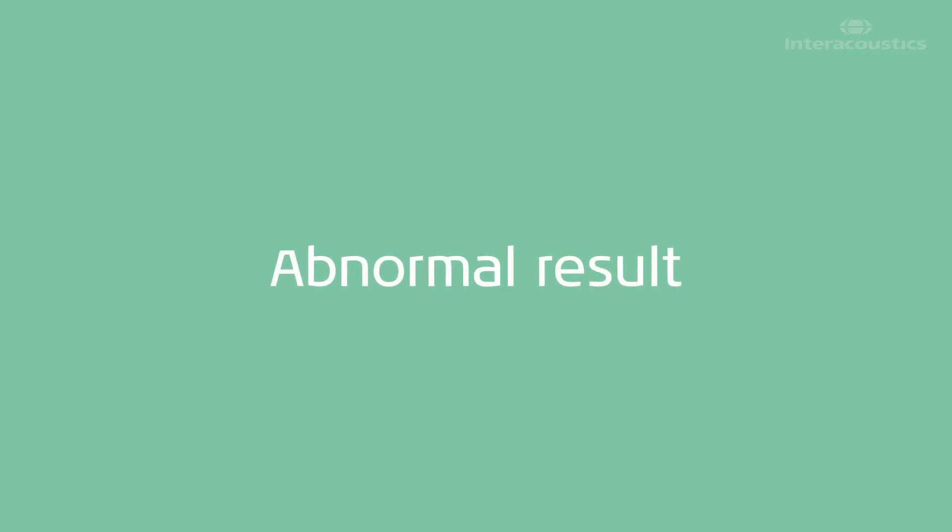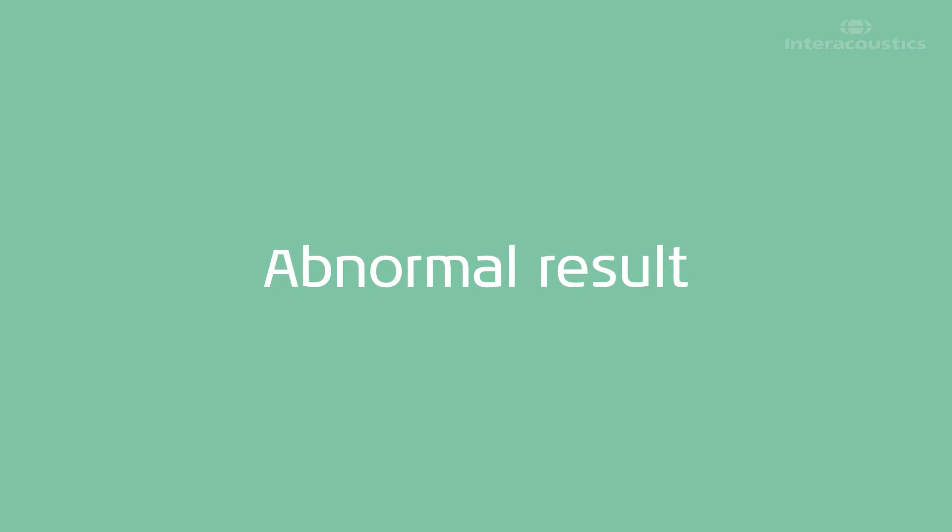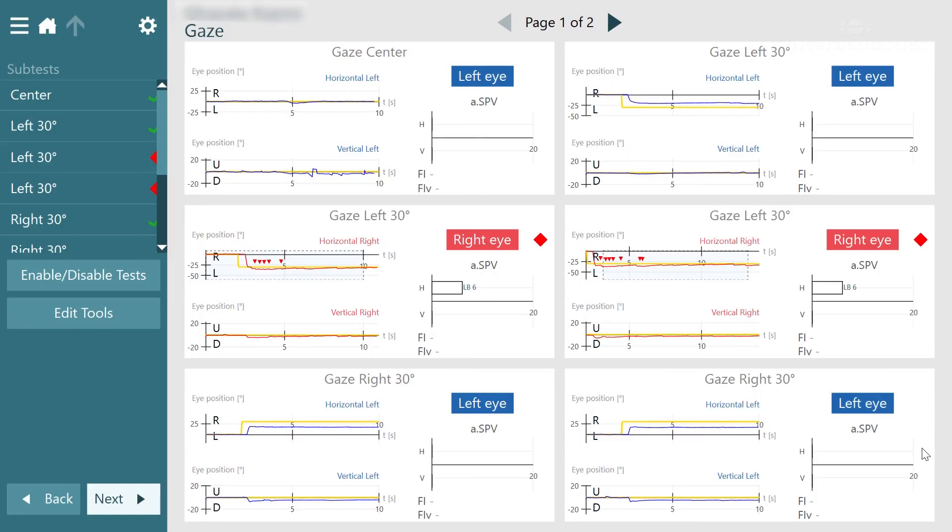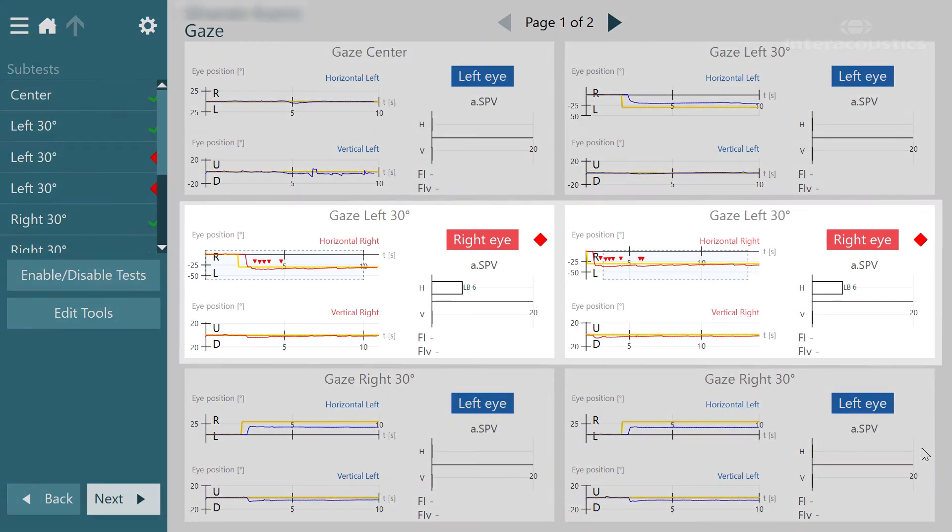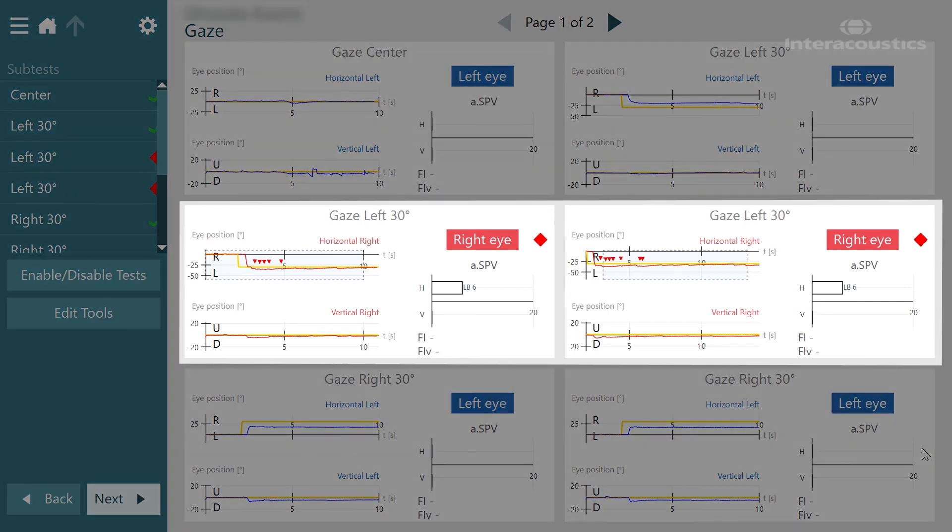So this is an example of an abnormal gaze test. What we can see is that when the patient's looking in the center conditions and to the right there isn't any gaze-evoked nystagmus. However when they look towards the left we can see a significant gaze-evoked nystagmus which only occurs during the beginning parts of the gaze.